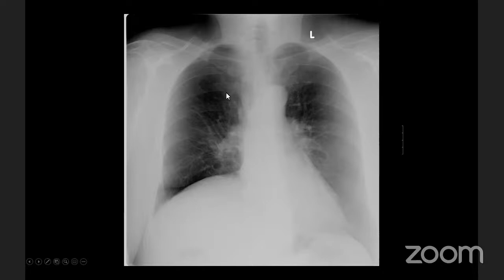And when you have a really badly penetrated picture, sometimes you have just dark spots in here. So those are areas just because there are less soft tissues. It's totally the role of the soft tissues. It's really underestimated by all viewers who are not experienced in that.